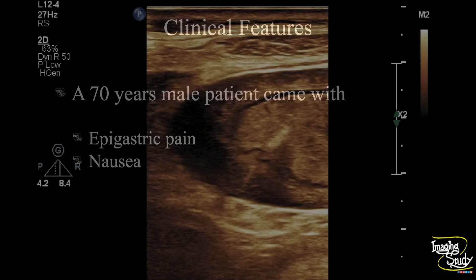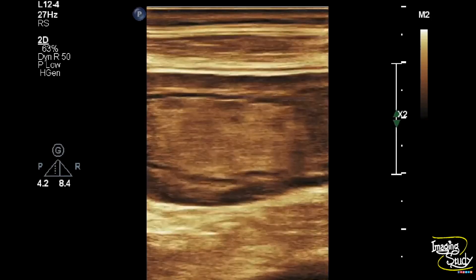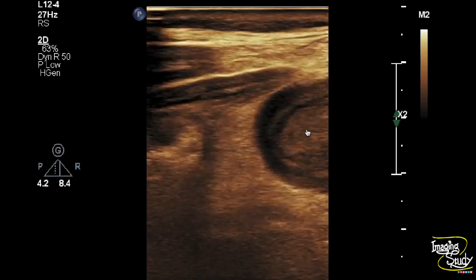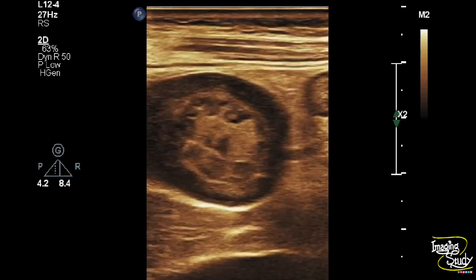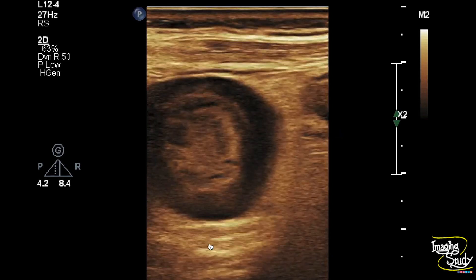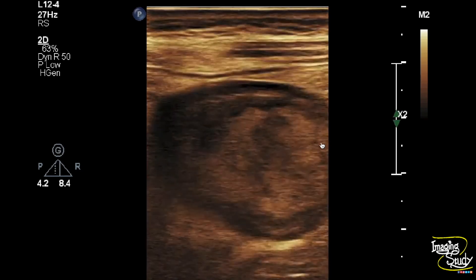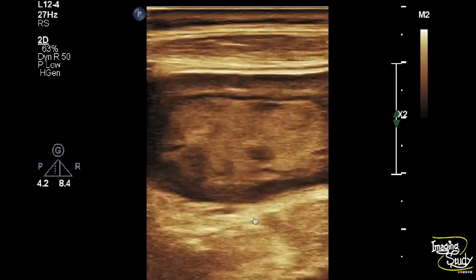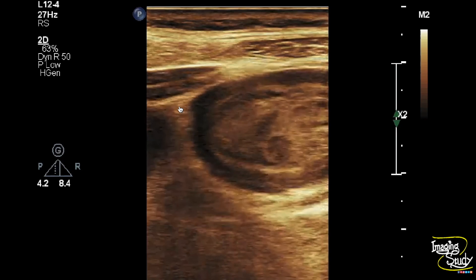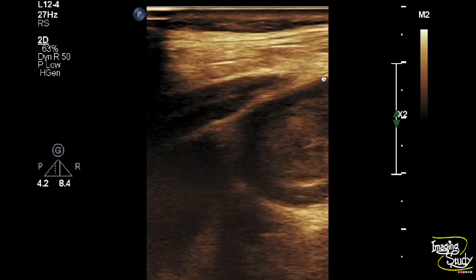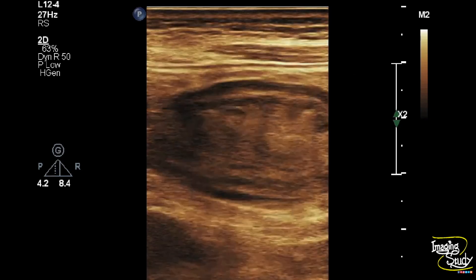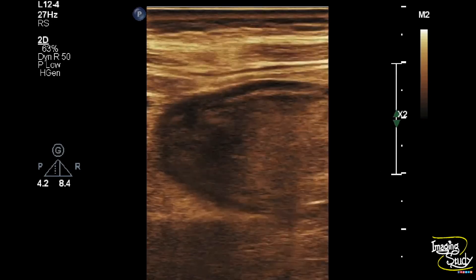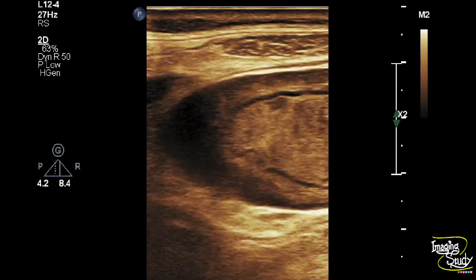Here you can see the high-frequency linear transducer view of the gastric antrum, showing the lumen is filled with food particles. You can see the hypoechoic thickening of the antral wall. On transverse section, you can easily understand this hypoechoic thickening is circumferential. There is no outer wall irregularity or adjacent lymph node enlargement.